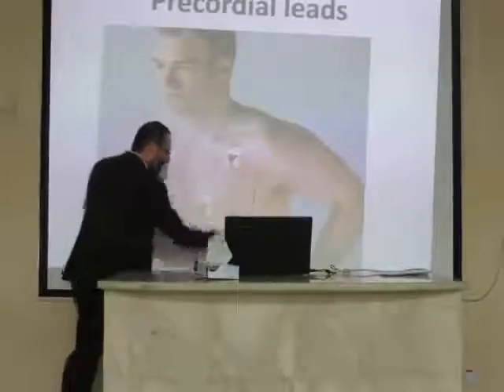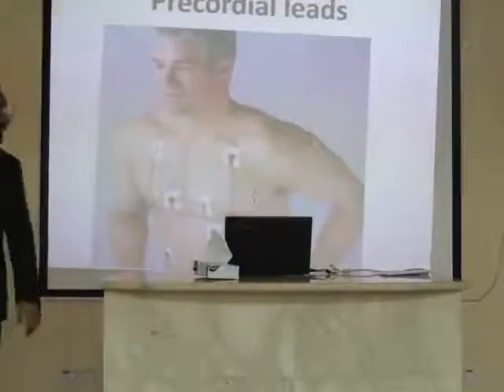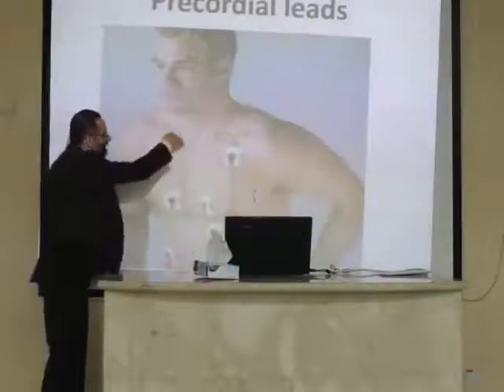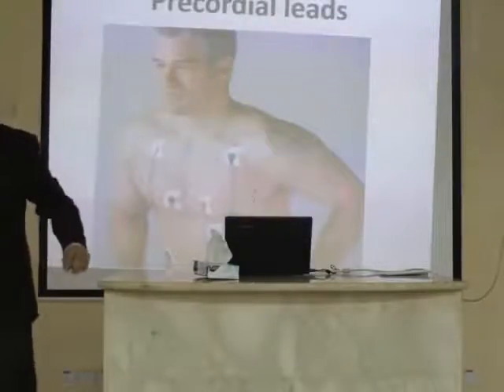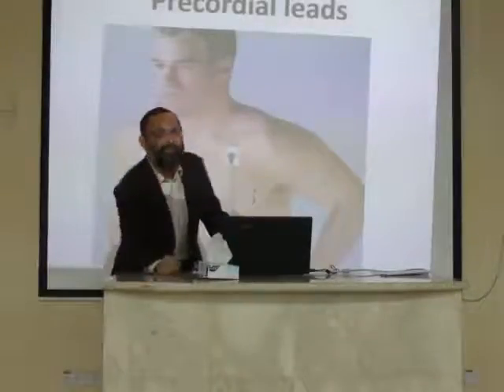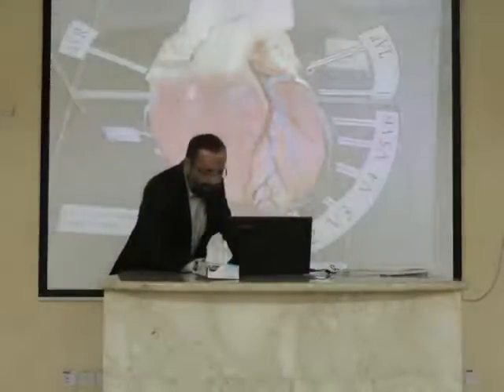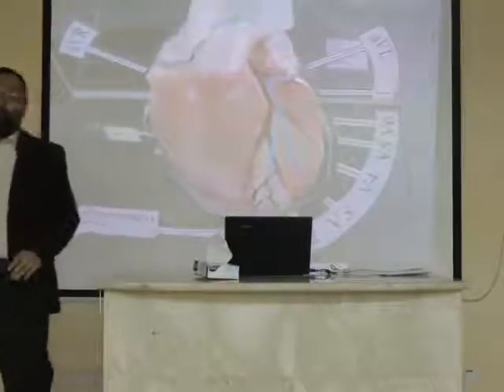These are the limb electrodes, the 4, and the remaining 6 electrodes are what? Oh yes. You know, this is a disposable system. You attach it here, you remove the wire, you remove the adhesive strip like a tape, and throw it away after doing the ECG. Okay? A convenient system, but obviously needs more money. Okay. Now a very, very important point is coming up.